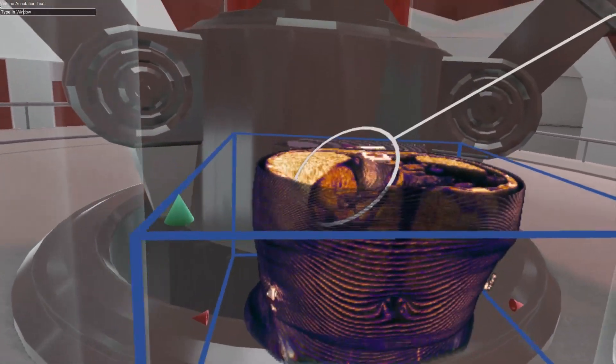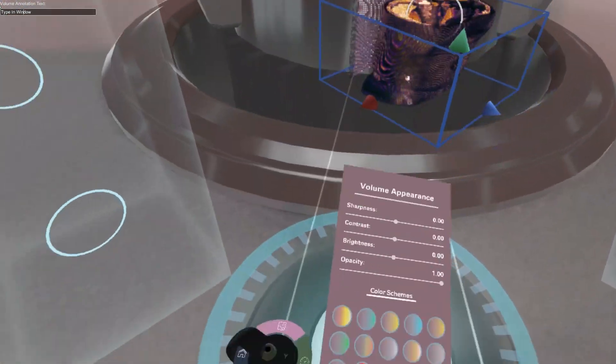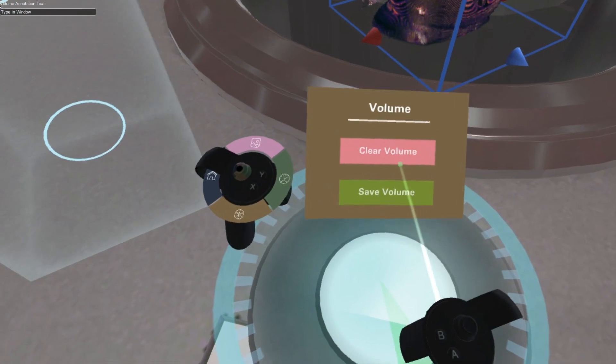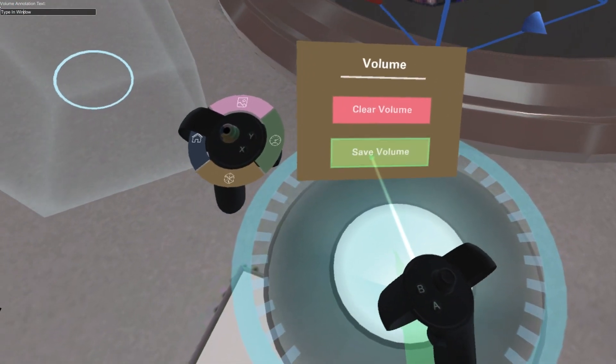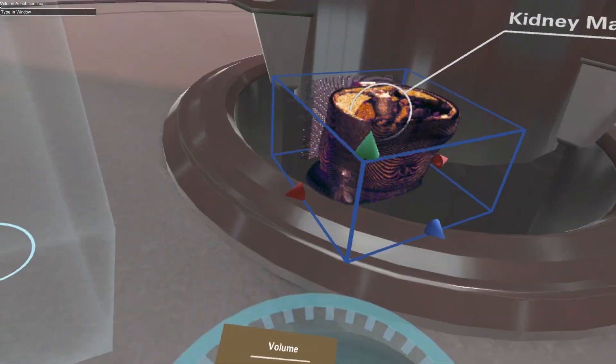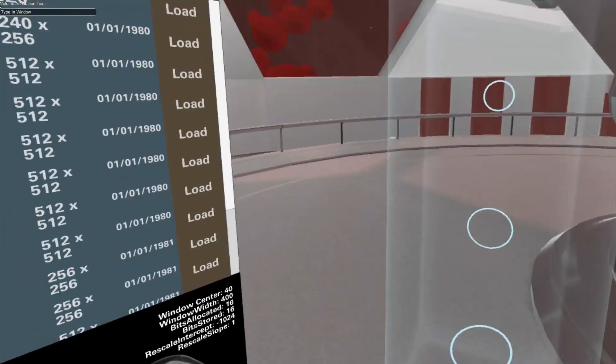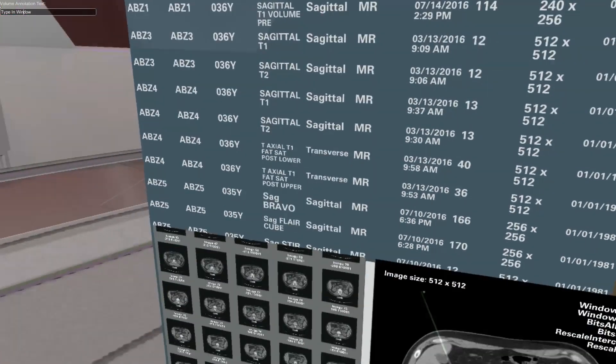The volumes can then be saved and uploaded to be viewed anywhere in the world. All patient health information is removed in the process.